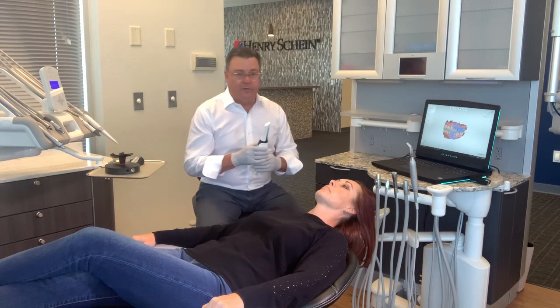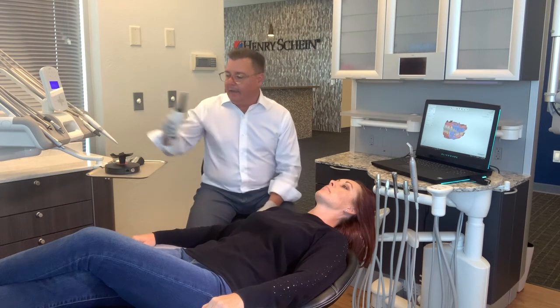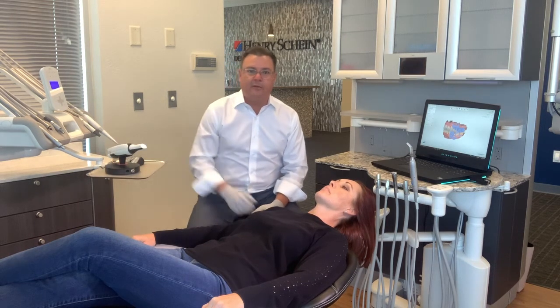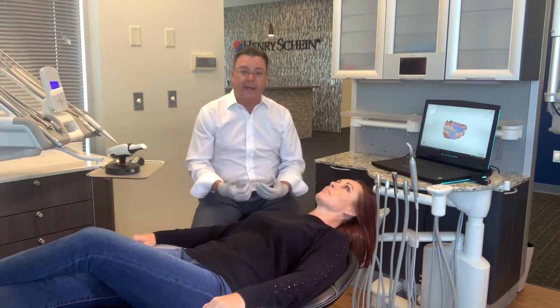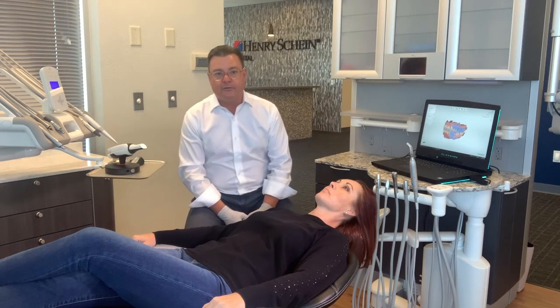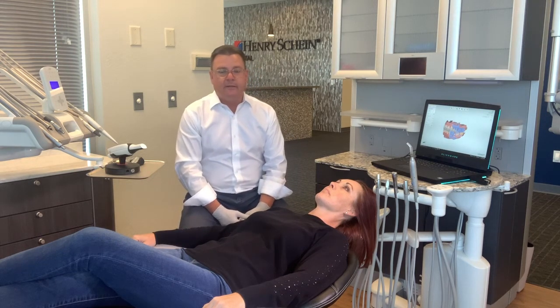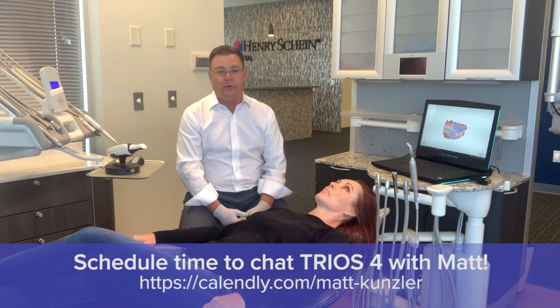All right, so there we go — upper, lower, and bite. We did that in just a few minutes. I hope this video was helpful and something you can refer back to if you have a TRIOS 4 and need a little additional training. If you don't have a TRIOS and would like to speak more about it, please reach out to your local Henry Schein representative, or you can find my information at the end of this video. I'd be happy to talk to you anytime.